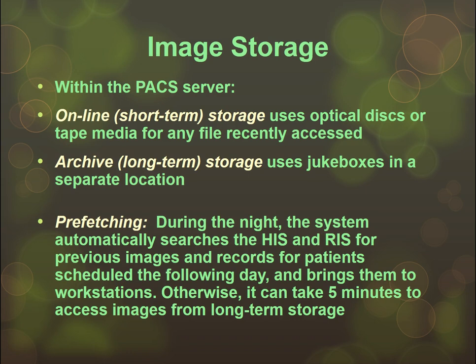Because you don't want the radiologist looking at today's chest x-ray, and he needs a comparison from last year, and having him wait 2 to 5 minutes for that to come out of the archive and all the way down to his workstation and come up. Radiologists, as you may or may not have noticed, are not the most patient people in the world. They're not going to be happy sitting there for 2 to 5 minutes waiting for these studies' prior images to come up. They want it all at the click of a button, and so that magic happens by prefetching.